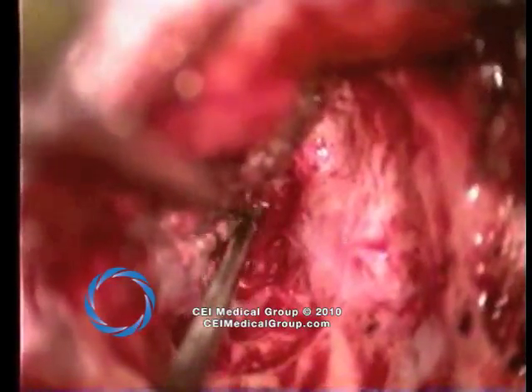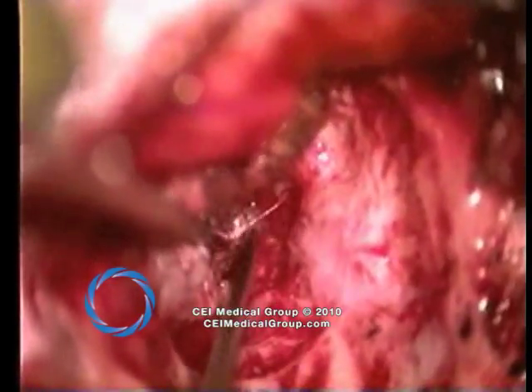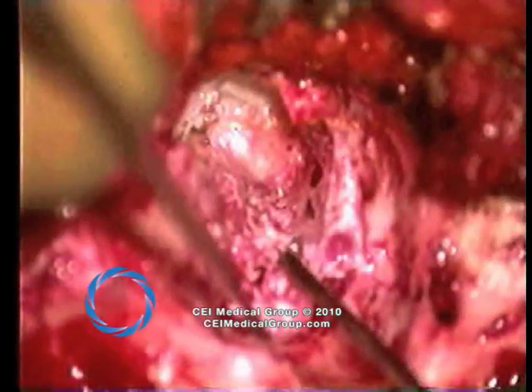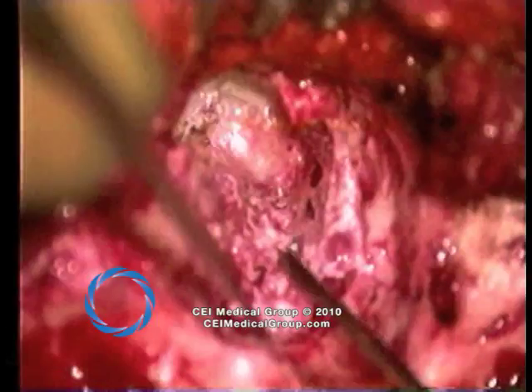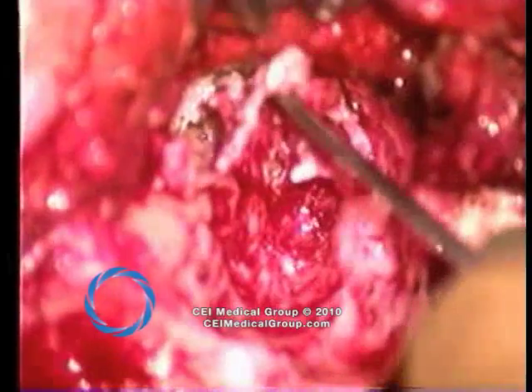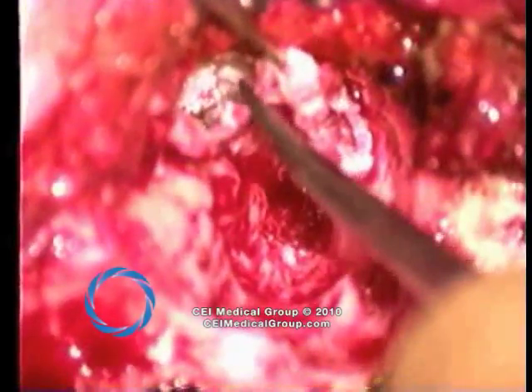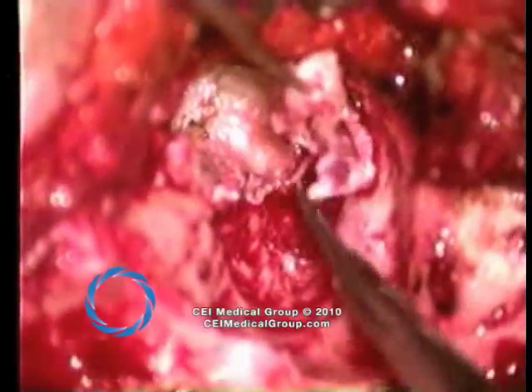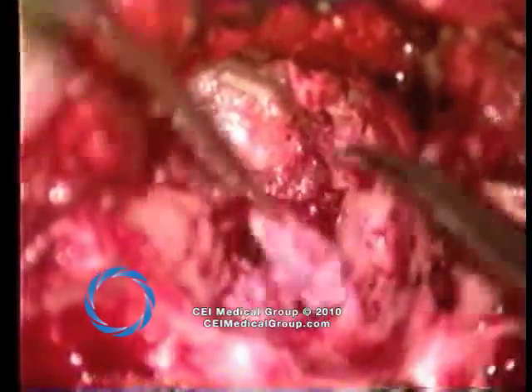If the surgeon cannot be entirely confident that all epithelium has been removed, then mastoid obliteration should not be attempted. Here you see the flap back in place, and anteriorly highlighted are the malleus, the tympanic membrane, and the mastoid bowl itself. In anticipation of reconstruction, flaps are left inferiorly and superiorly to be placed over the obliterated space.